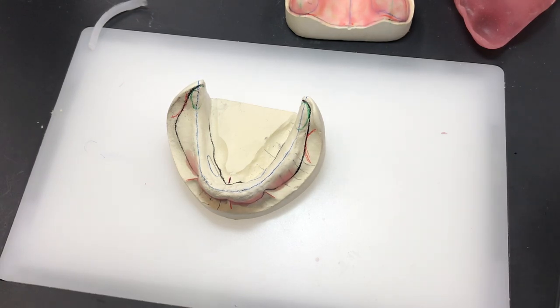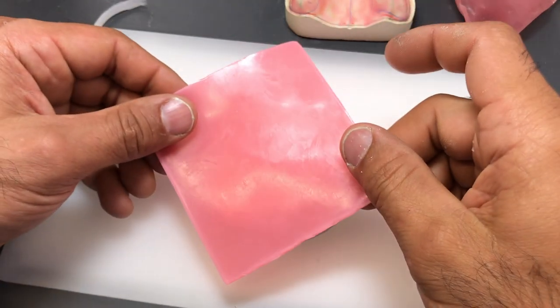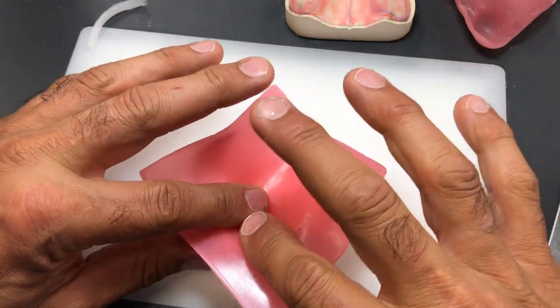It's important not to melt the wax as you're doing it over the Bunsen burner, as I'm doing now, but create a uniform, soft consistency of the wax. So you have to flip the wax back and forth over the Bunsen burner and rotate it, and make sure that the corners of the wax as well as the center of the wax are equally heated, warm enough, so you get that consistency. And you can see a little bit of blanching of the wax as you heat it up.